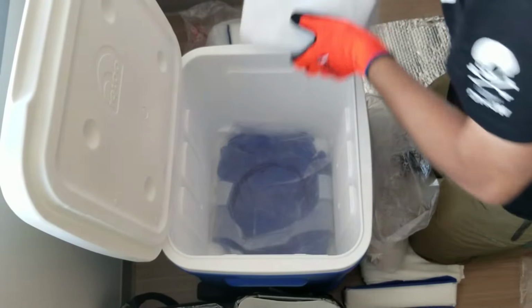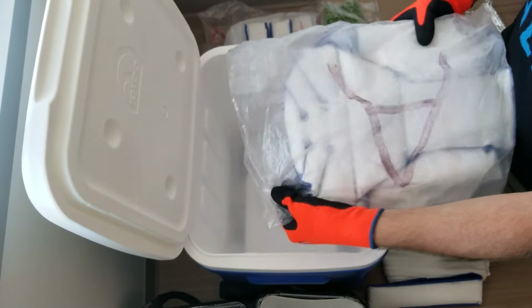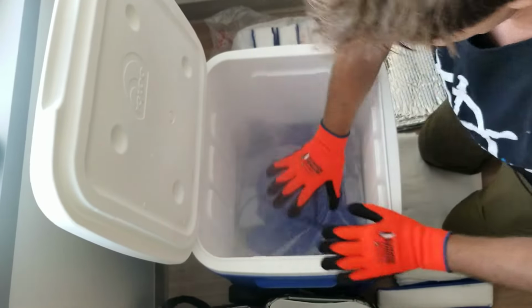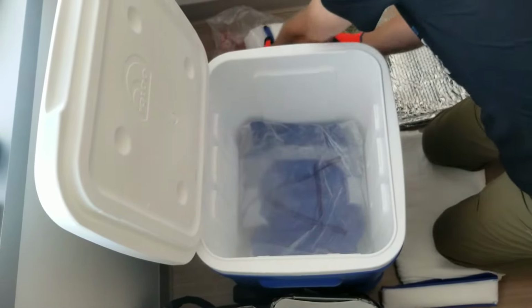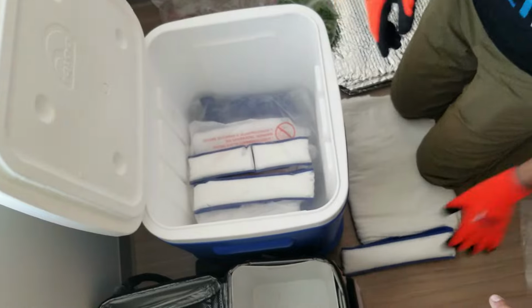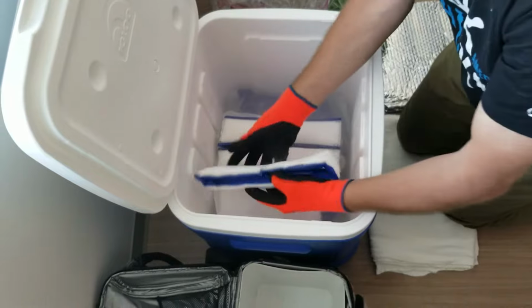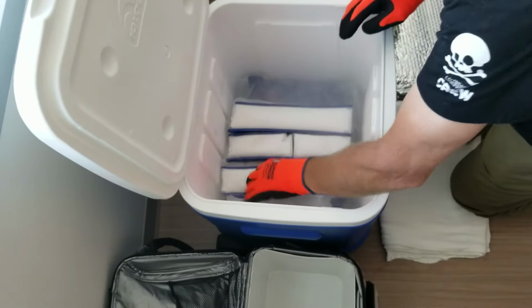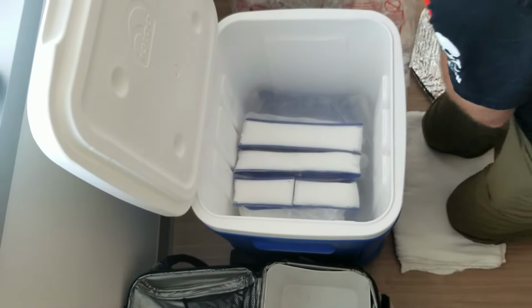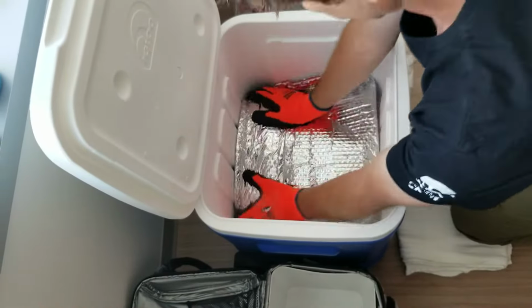And now I take another layer of dry ice, put it in there. You want to work fairly fast. And then I take the one that I just took off the bottom, and it goes white side to the dry ice. And then I take the extra dry ice that I have for the top. I've got my other strap, which is somewhere right there. This is the side that's really the cold side that I like, and I just like to put that in the dry ice. And then maybe I'll flip this one over, because that just got put in there. And I'll flip this one over so it's nice and cold. And then throw my peas back in here to keep them cold. Throw this blanket back on, keep it nice and cold in there.